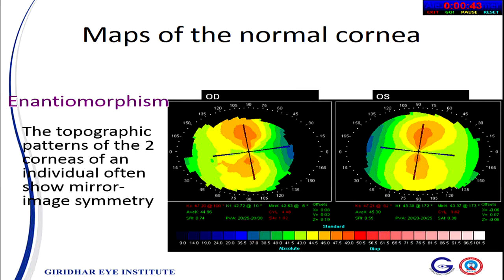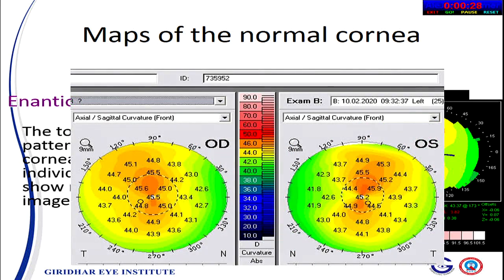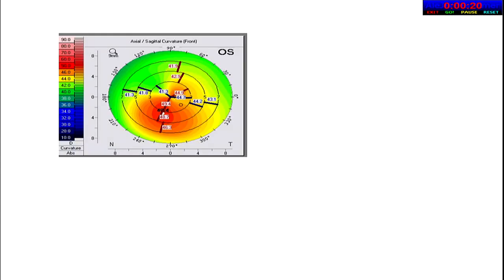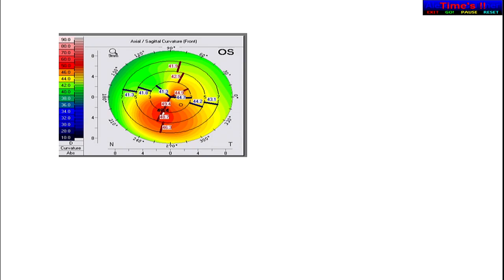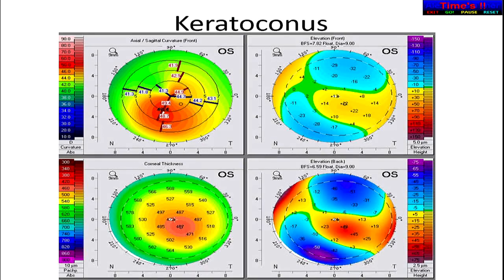Enantiomorphism — a term from biochemistry — means one cornea is a mirror image of the other. Looking at right and left corneas of the same patient, they are mirror images. Enantiomorphism indicates a normal cornea — a very good sign. Can someone describe the findings in this sagittal curvature? Asymmetric bow tie with inferior steepening. The other important feature is skewing of the radial axis. The rest of the picture of the same patient shows posterior elevation and thin cornea — features of keratoconus. The other picture shows a symmetric horizontal bow tie, indicating against-the-rule astigmatism. Looking at the pachymetry map — normal or thicker. With this information — normal surface topography and normal thickness — this is a normal cornea.